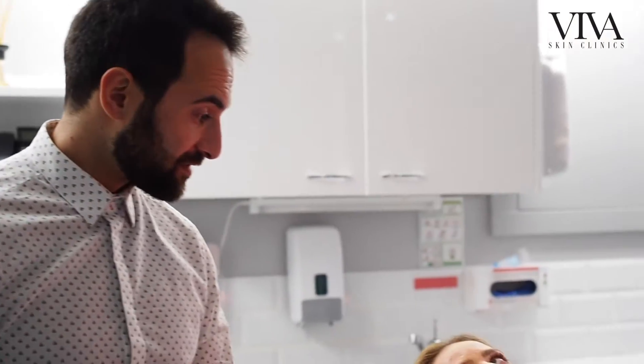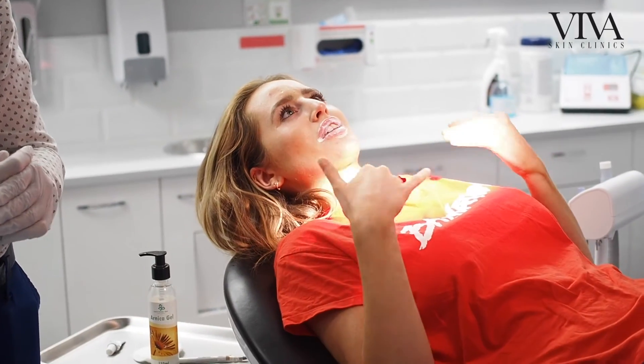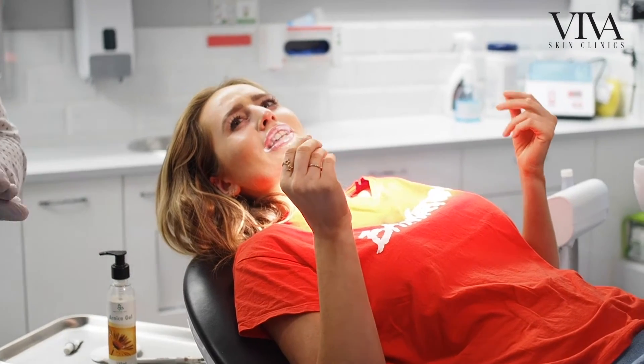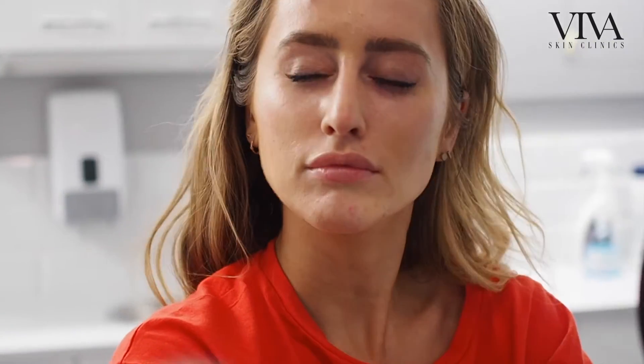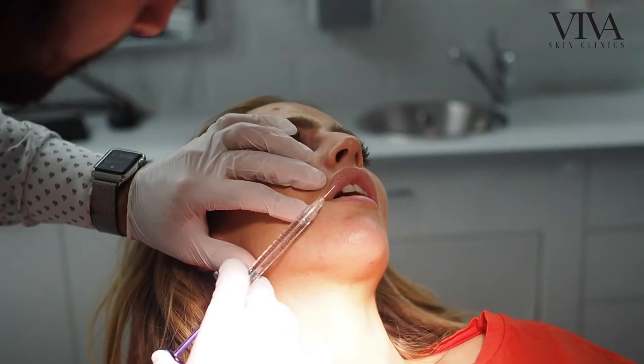I'm sure Sophie will be able to describe how they're feeling — they'll start to get really numb. Yeah, definitely you can feel the sensation starting to kind of come out of them quite a lot, and it's a really good feeling actually. So for nice, soft, natural looking lip enhancement, we're using 0.5 mils, putting a little bit more in the top lip and also proportionally balancing the bottom lip. Sliding back here, that's great. First injection coming.